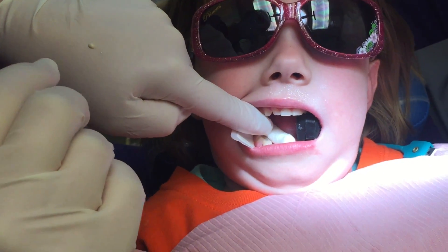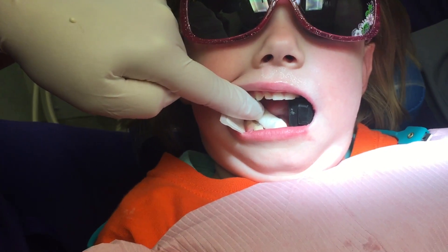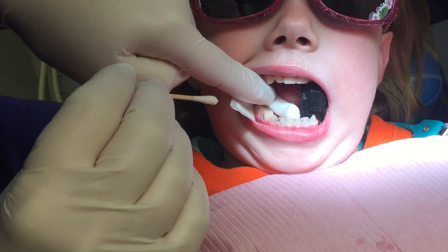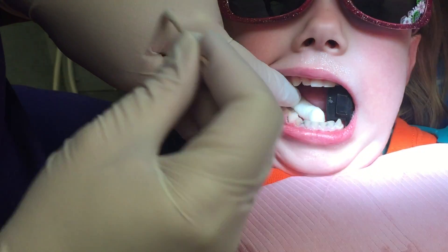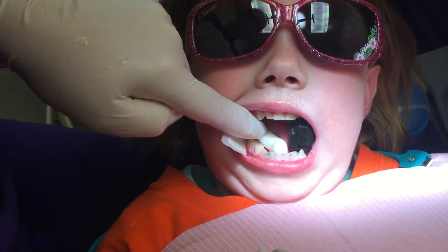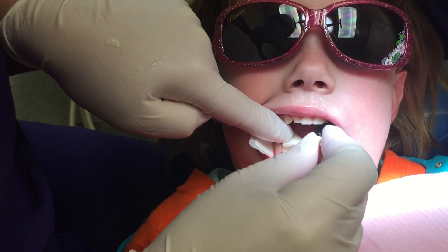We could always add it again. See how it already looks magical? We're just waiting for it to get a little bit thicker. The Triage is a little bit runnier but it gets into the little crevices.